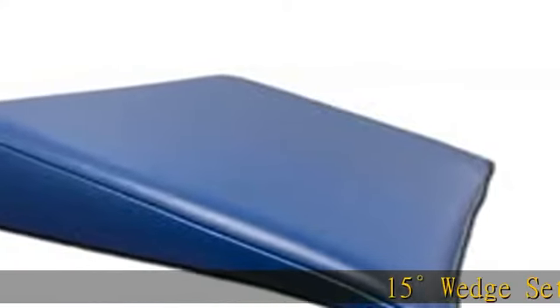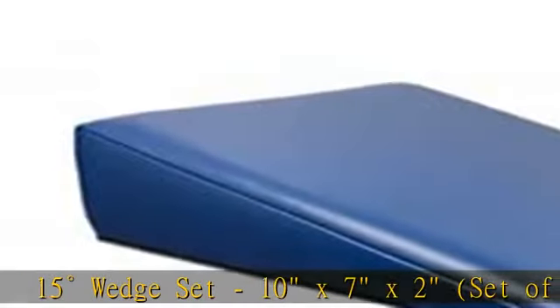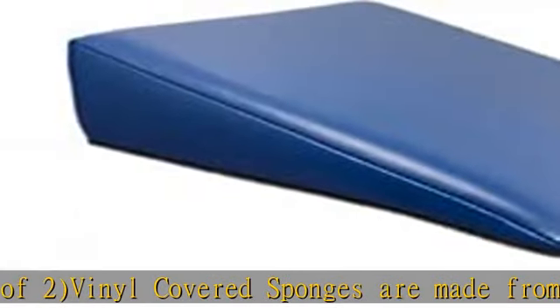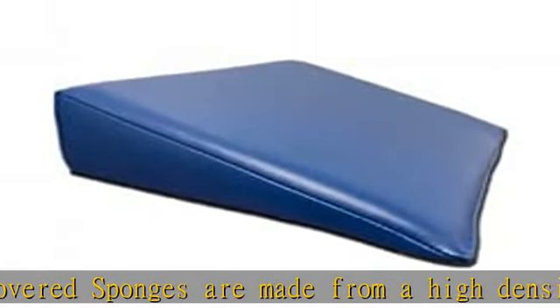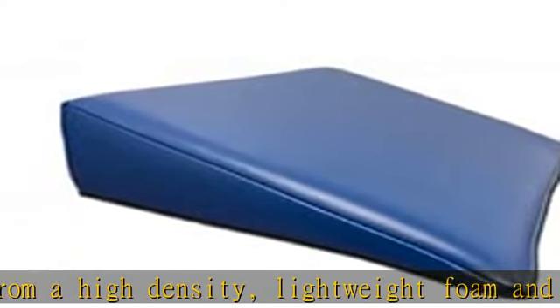15-degree wedge set, 10x7x2, set of two. Vinyl covered sponges are made from a high density, lightweight foam and covered in royal blue, heavy gauge reinforced vinyl. These premium positioning sponges help create extreme patient comfort during long procedures.